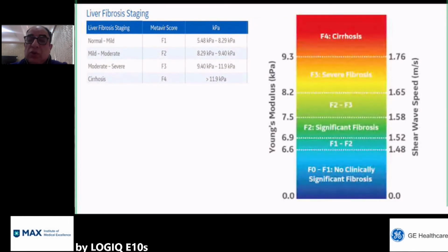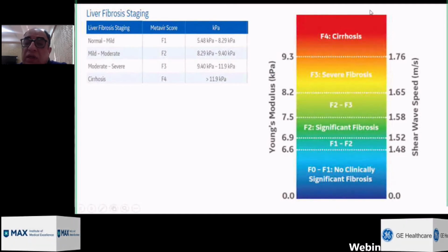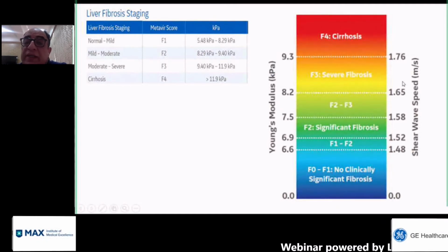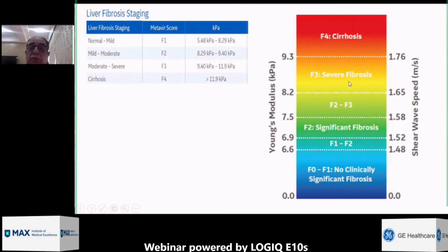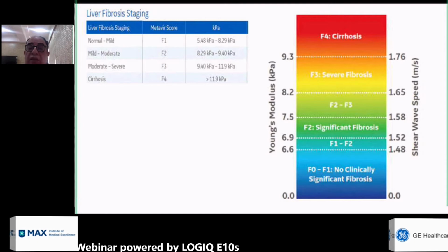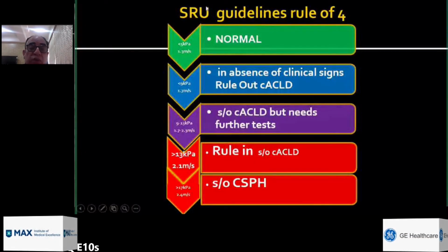So we also use a lot of graphic display when we give the reports in terms of where exactly the patient stands. And this is very, very important, because patients understand numbers and they understand graphics, and it plays on them to know where they stand.